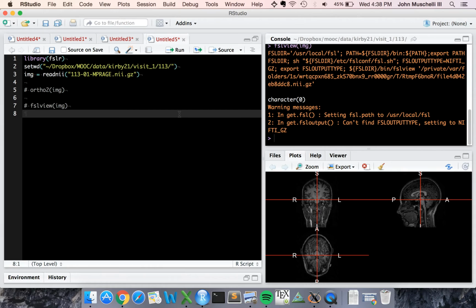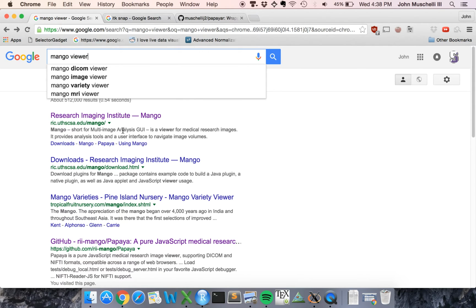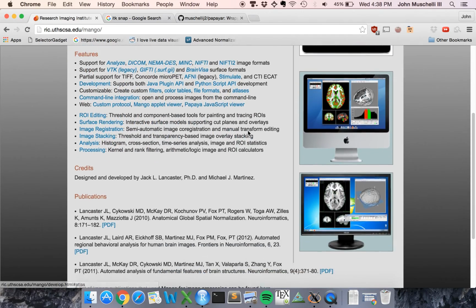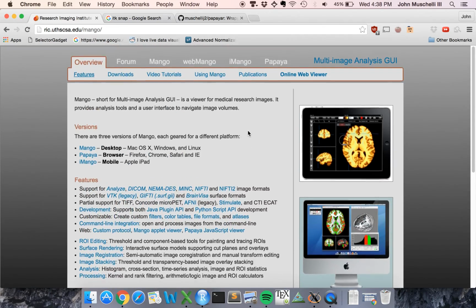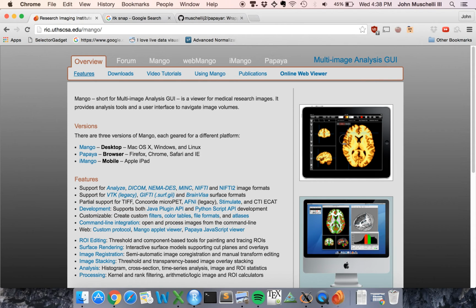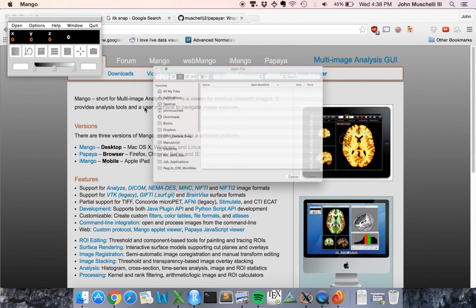There are some different viewers out there that some people think are better or worse, and one of them out there is called Mango. If you just Google Mango viewer, you'll find the Research Imaging Institute, Mango. It has a lot of information here about what it supports and all this kind of stuff. But Mango is, again, a third-party piece of software, not included in R, and I'm going to bring it up right now. That allows you to look at slices of an image interactively. So let's open an image.